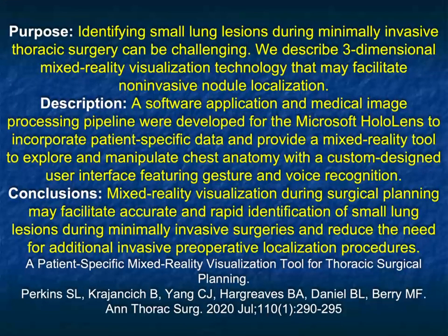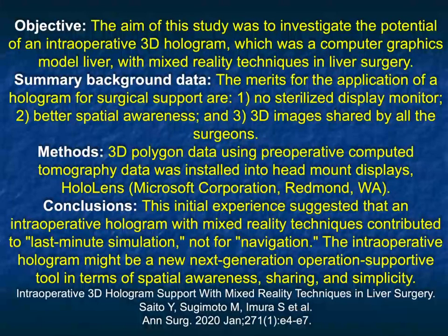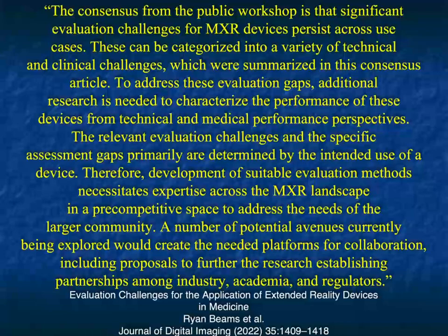So this is really talking about using augmented reality in the surgical suite. And there's been work done there. Here's an article about liver surgery. The initial experience suggested that an intraoperative hologram with mixed reality techniques contributed to last-minute simulation, not for navigation. The intraoperative hologram might be a new next-generation operation supportive tool in terms of spatial awareness, sharing, and simplicity. Again, lots of potential, and we'll have to see where this goes.